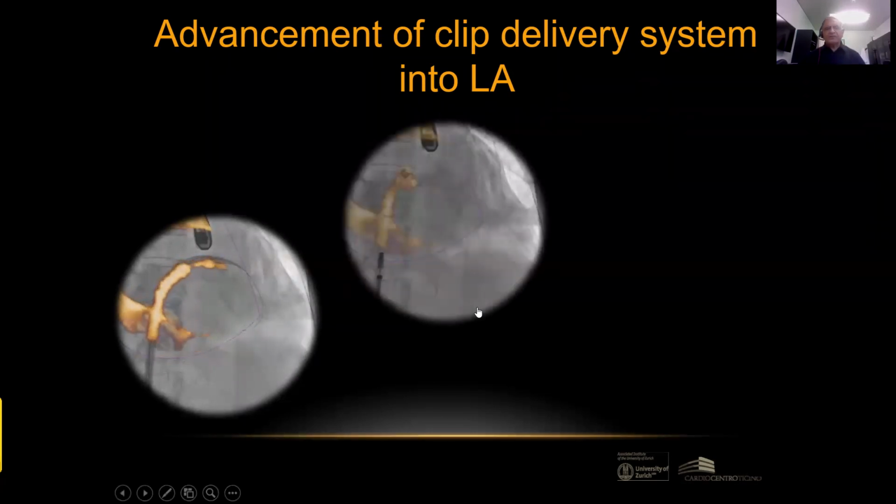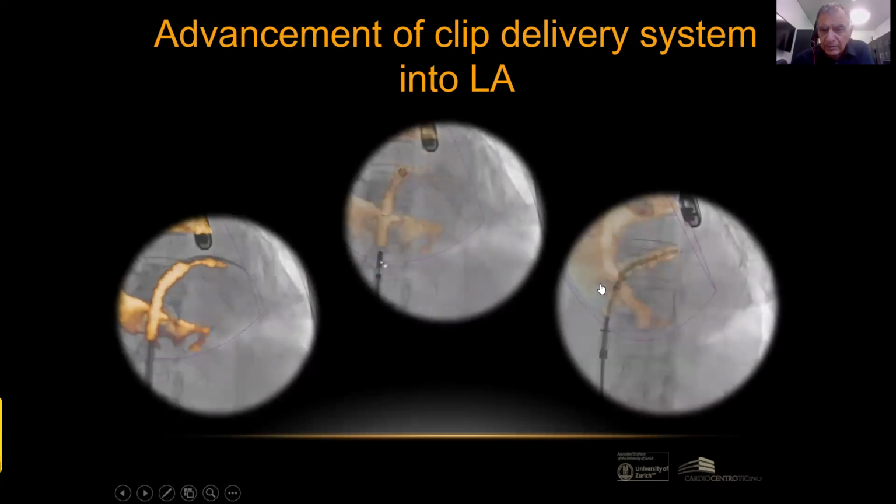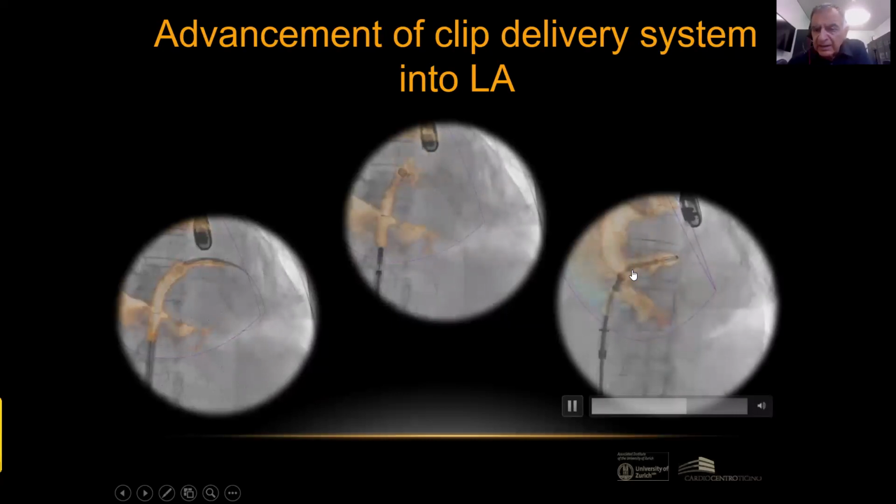And for example, these are quite beautiful images in which you can see the clip in the fluoroscopy, and then you can see the catheter in the echocardiography, and then you can see the clip moving in fluoroscopy. You see it crossing the septum and going to the tip of the catheter. And at the end, we try to steer the catheter towards the mitral valve, which is here.